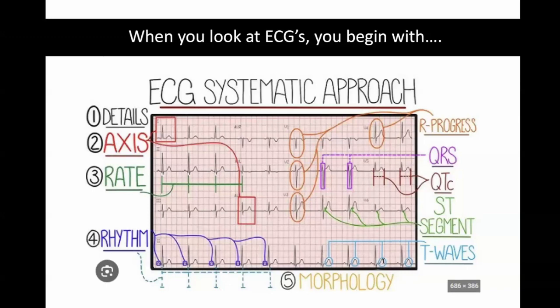The pediatric ECG, as the pediatric patient grows up, will change. In order to get a better understanding of this and to make sure that you interpret the ECG correctly, you will need to understand what normal values are for the certain pediatric age groups. We will look into these in more detail in the upcoming slides.